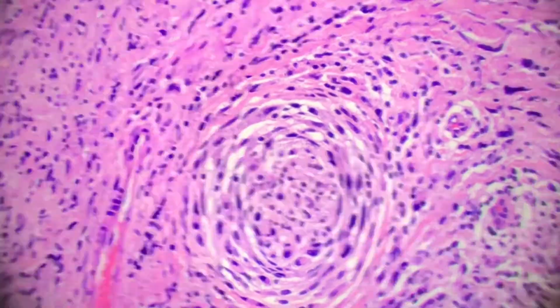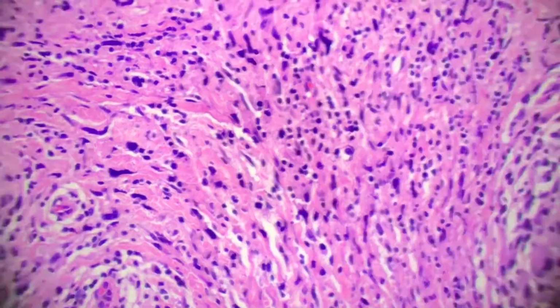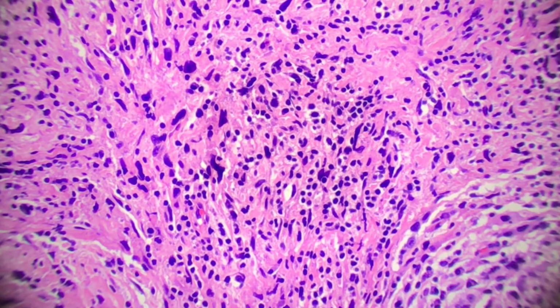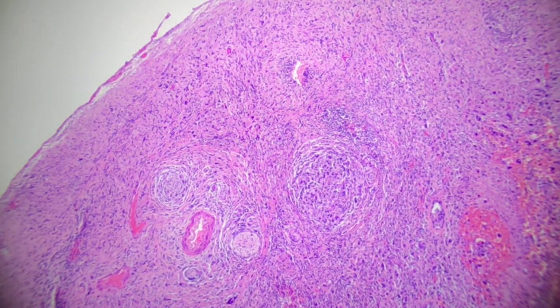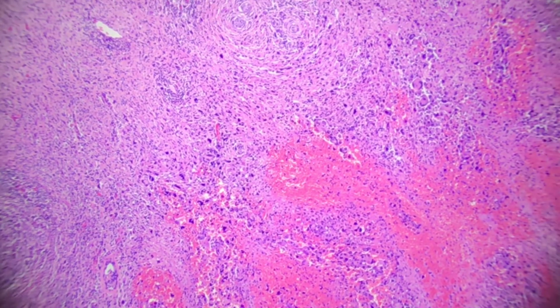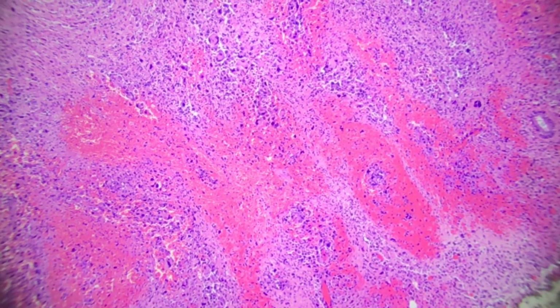But the cells are still really atypical. Right? These nuclei are not round, ovoid. They're not plump like we would expect to see with reactive fibroblasts. They're very, very irregular, very hyperchromatic, and we have this lymphocytic background as well. These are often associated with ulceration. You can see necrosis in them. And the ulceration tends to complicate things because you get a lot of hemorrhage, and then you start to think about, is this really a vascular lesion?